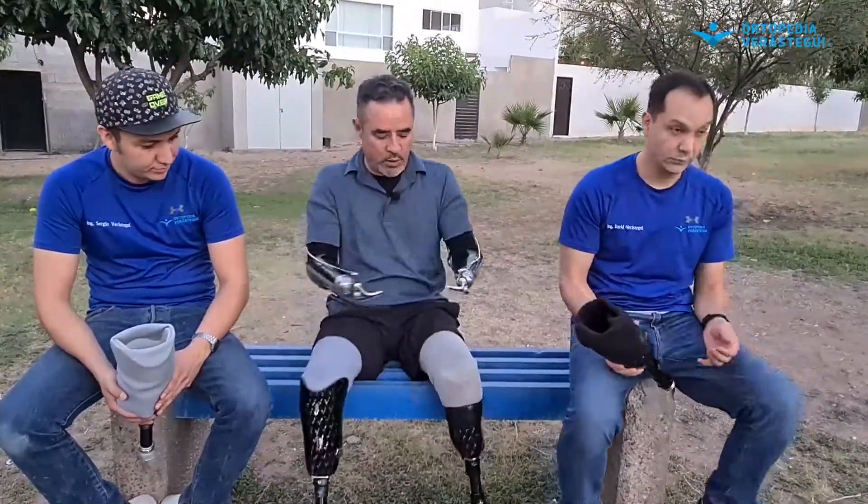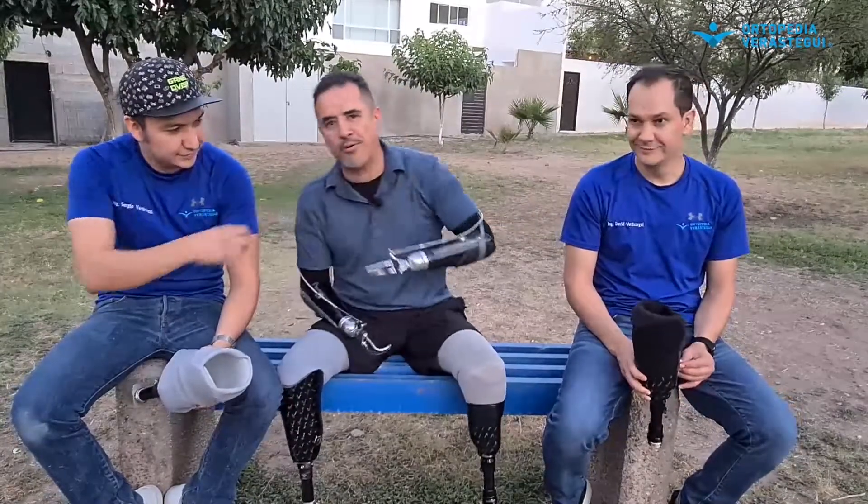Vamos a hablar de lo que es el sistema de sujeción, de lo que uso ahorita y de lo que estaba usando antes. Me acompañan Sergio Verastegui, que es mi protesista directamente, y David Verastegui, que también es protesista.